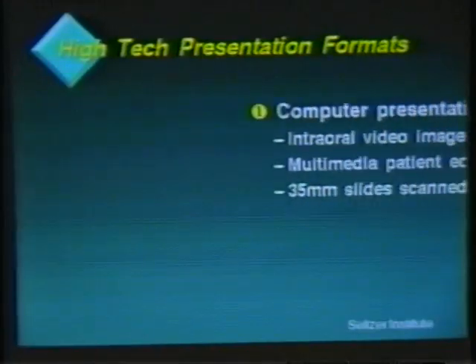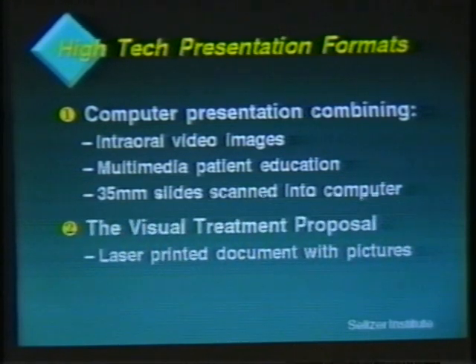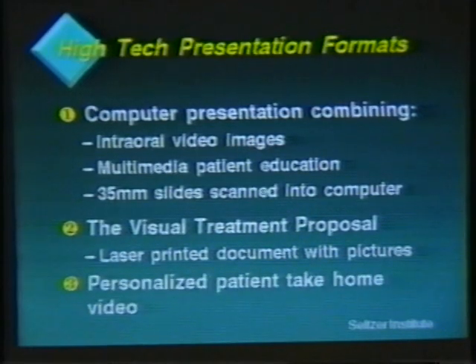A computer presentation that combines video images, patient education, and 35mm slides, a laser printed treatment letter containing these images, and a personalized patient take-home video. First, let's look at the finished computer presentation, then I will show you how to create your own.